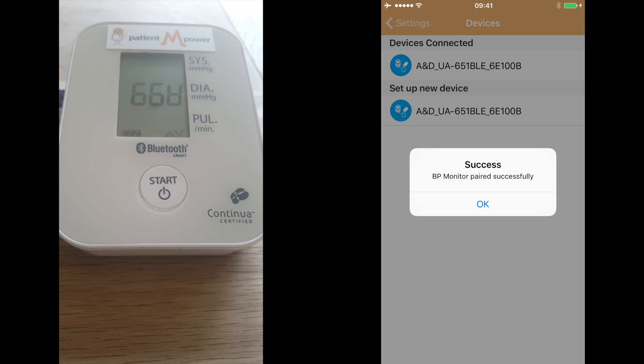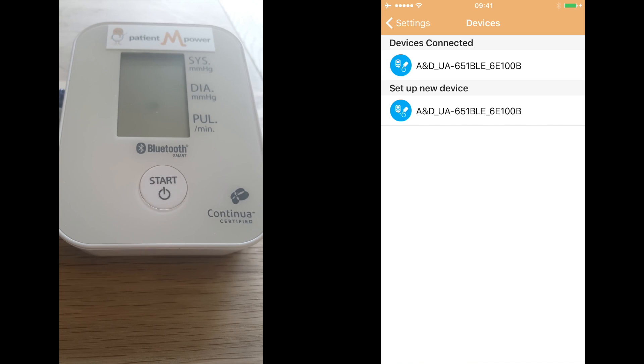Then click OK once it reports that it has been paired successfully, and you are now ready to take blood pressure readings.